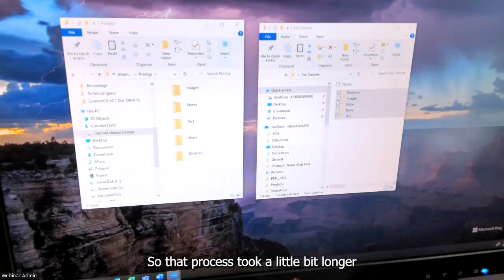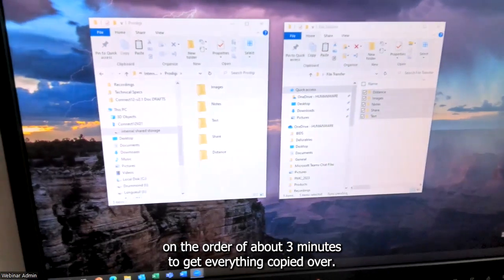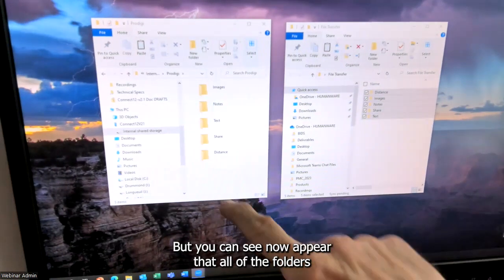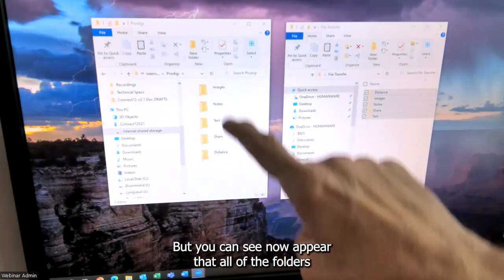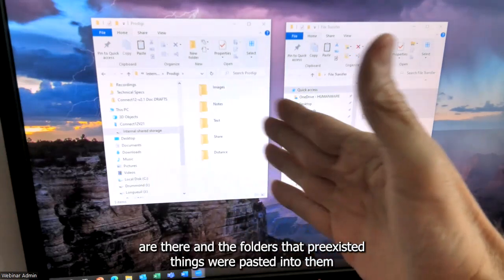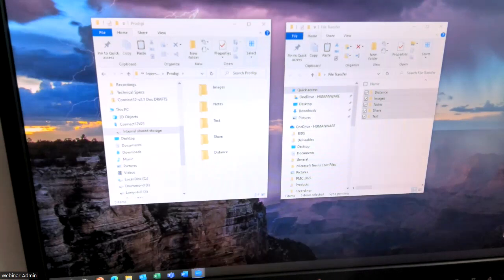That process took a little bit longer — on the order of about three minutes to get everything copied over. But you can see now that all of the folders are there, and the folders that pre-existed had files pasted into them as appropriate.